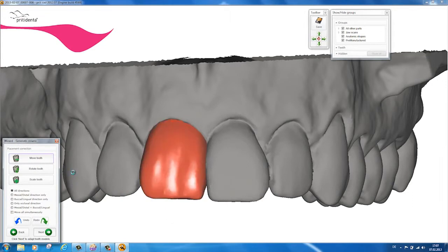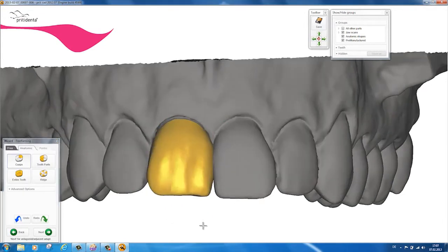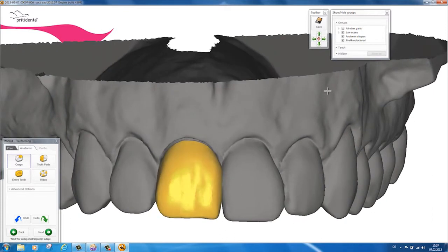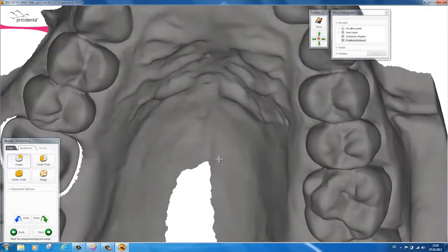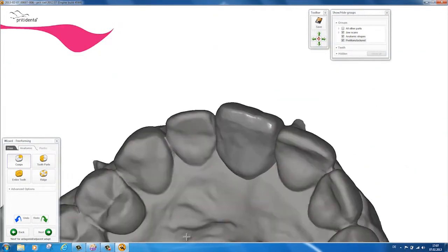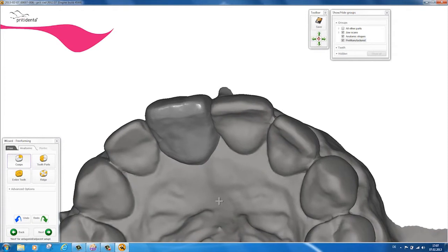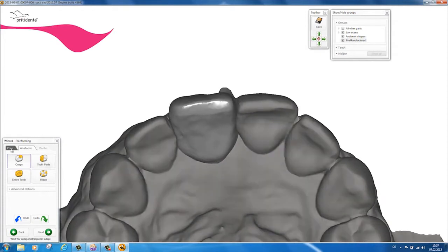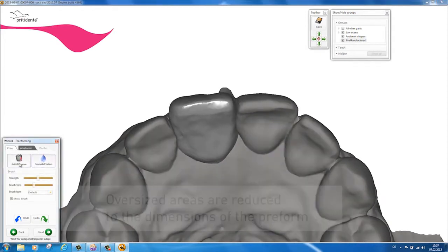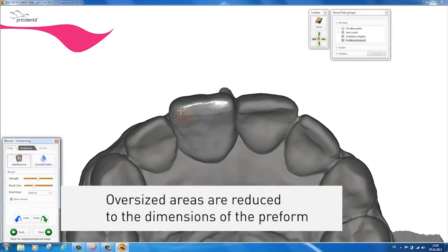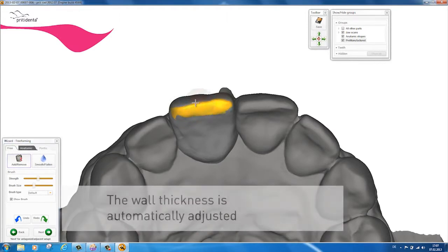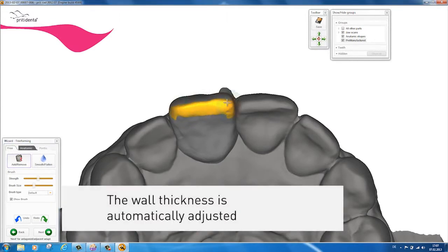You can use the Add tool to apply extra incisal material. Remember that yellow areas lie outside the working area of the prefab and will be calculated back down to the geometry that can be fabricated. The dimensions of any parts that are thinner than the recommended wall thicknesses will be automatically increased, provided there is room in the prefab.